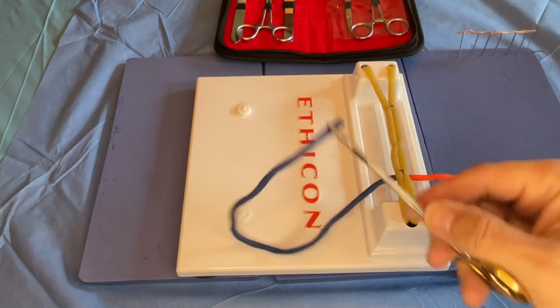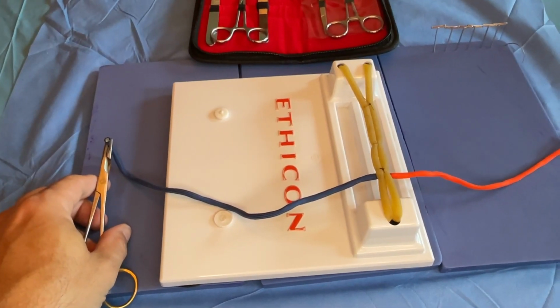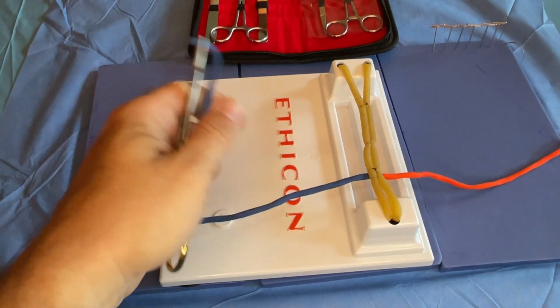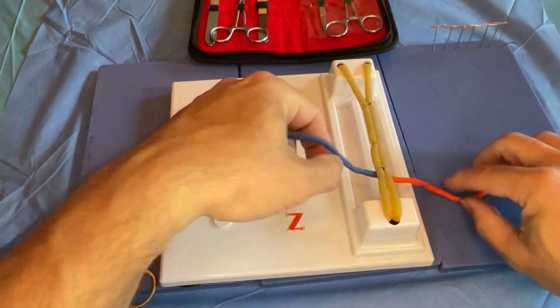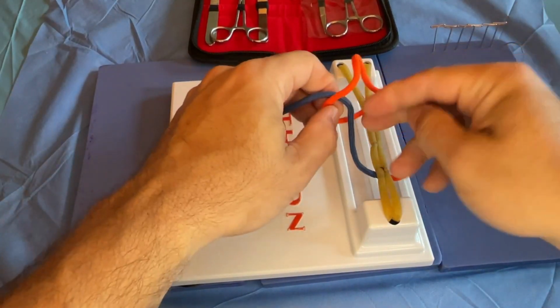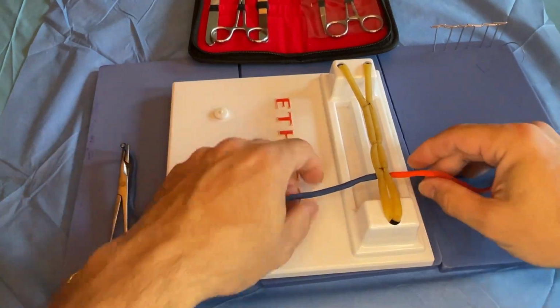So we've driven it through the tissue. We have our needle driver here. And what I prefer, and this is just strictly speaking personal preference, is to keep the needle driver in my left hand, or to set it down to the left of wherever I'm suturing. And then what I do, knot tying in general is just about creating loops and pulling a free end through a loop. So that's what you do, whether it's a two-handed or a one-handed knot.